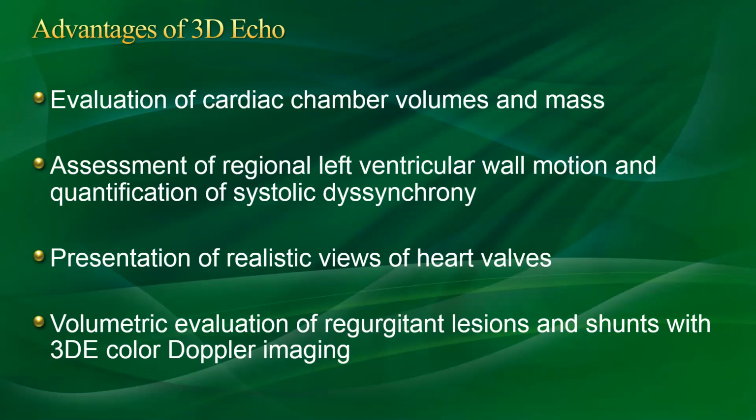Like the example I showed you with that flail A2 segment of the mitral valve and the mitral cleft, that is very hard or no way to diagnose with 2D echo. It also helps us with a volumetric evaluation of regurgitant lesions and shunts by adding 3D color.